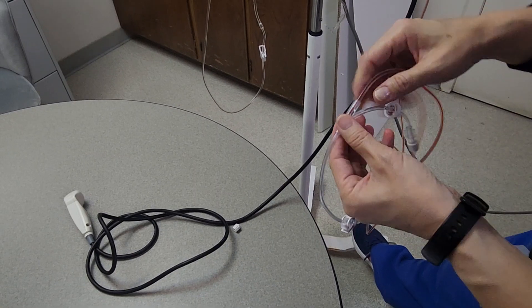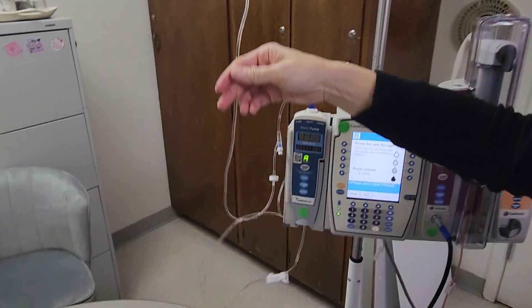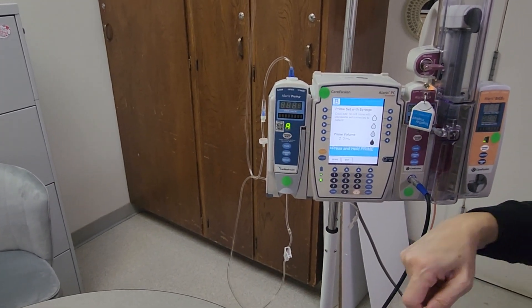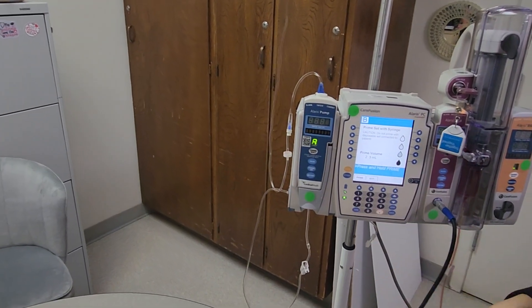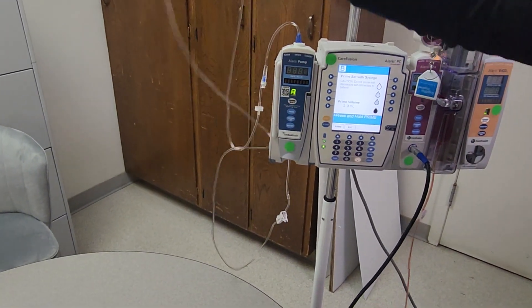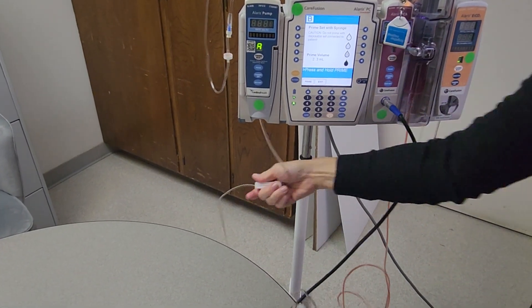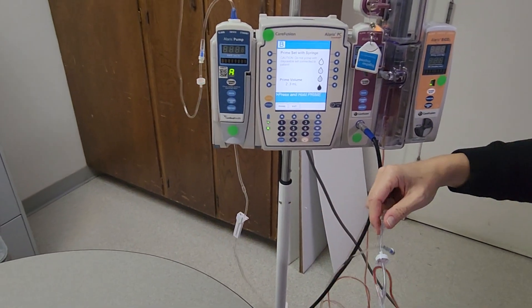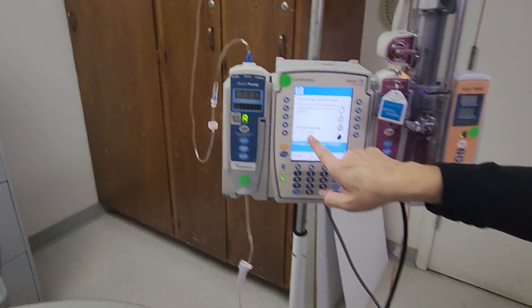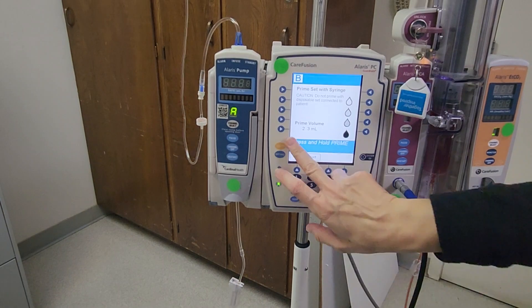When you reach the Y, the next portion you fill will be with the carrier fluid, which should already have pre-primed tubing on the pump. You can take that off the pump, attach it, and flush quickly with saline, or do it on the pump. Use aseptic technique, attach the tubing, and make sure your roller clamp is open. The priming volume was 2.3 milliliters, which will be captured — it's important to account for all of the medication and where it has gone.